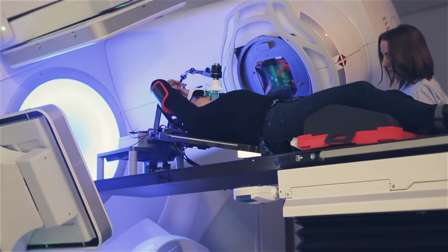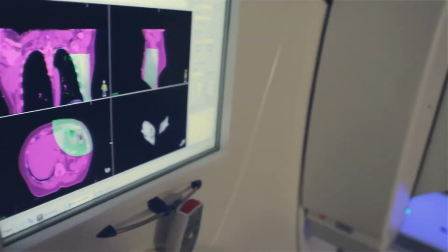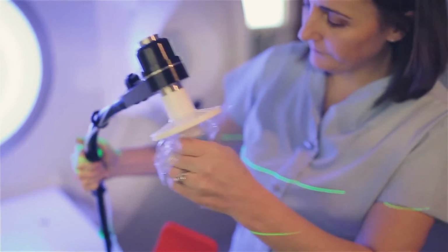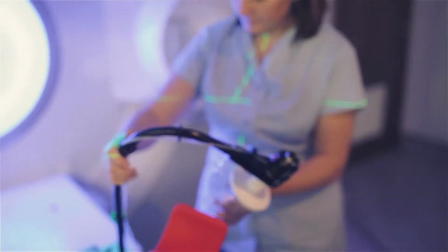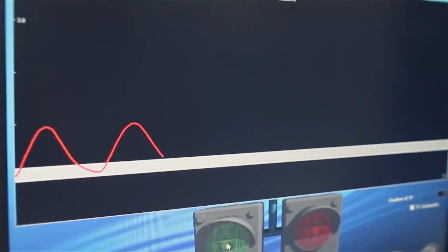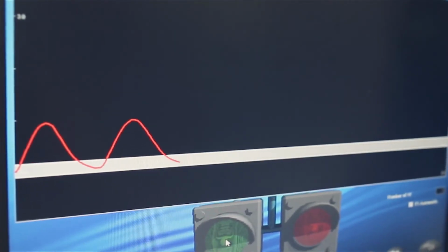To administer the deep inspiration breath hold technique, we ask the patient to wear a mouthpiece, which is attached to a spirometer. It doesn't look dissimilar to a snorkel mouthpiece, and they simply breathe in and out. They also wear a set of visual display goggles, which show a screen with a very simple traffic light system indicating when they need to breathe, hold their breath, and then breathe away normally.